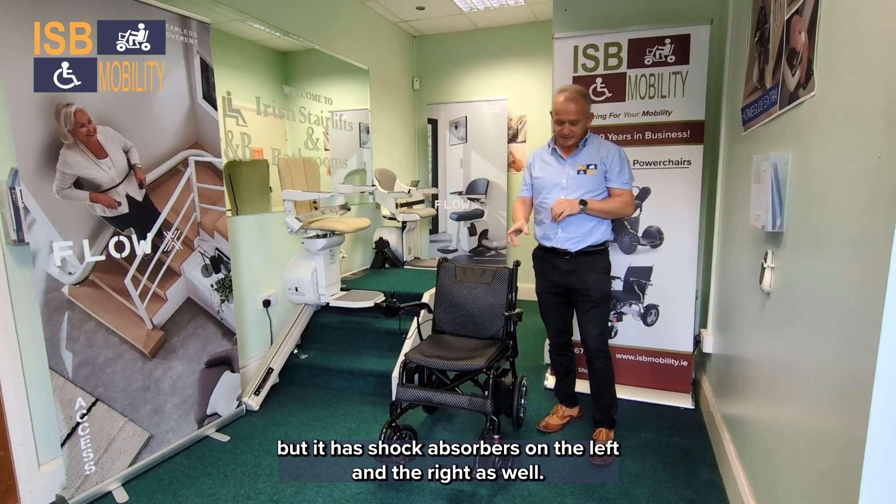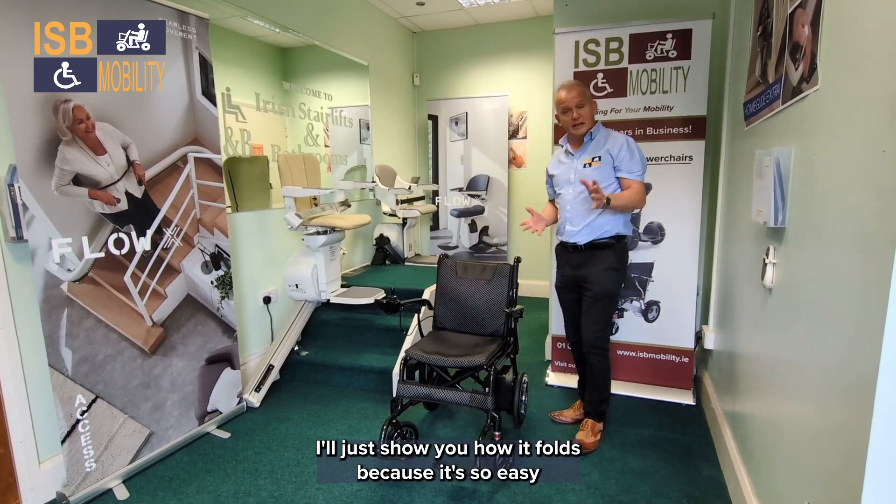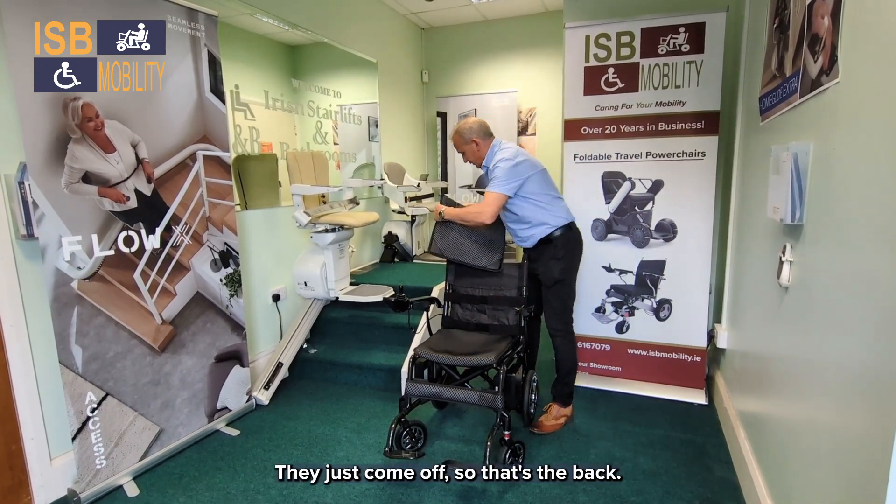And anti-tilt. The tires on this model are solid, but it has shock absorbers on the left and on the right as well. I'll just show you how it folds, because it's so easy — just take off the velcro covers; they just come off.